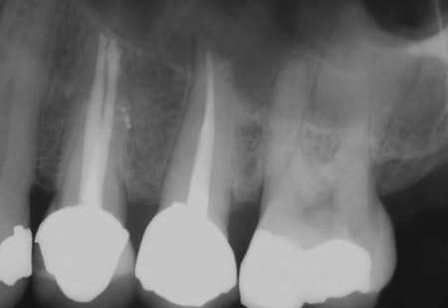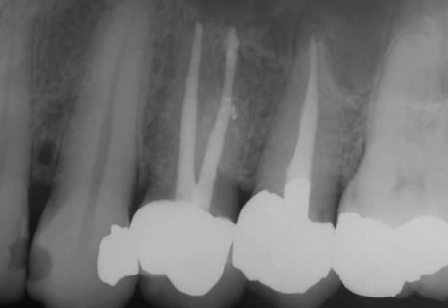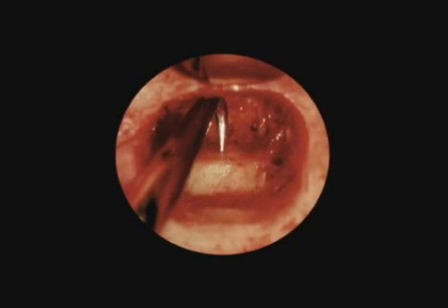Here's a case that illustrates a Type 3 transportation. Preoperative films of a maxillary left first bicuspid show a packed buccal canal that does not fulfill the mechanical objectives for shaping canals. Following flap elevation, a surgical photograph shows gutta percha exiting through a significantly ripped, torn, and relocated foramen. A surgical photograph shows the osteotomy, apicoectomies, and the ultrasonic root-end preparation associated with the lingual canal.